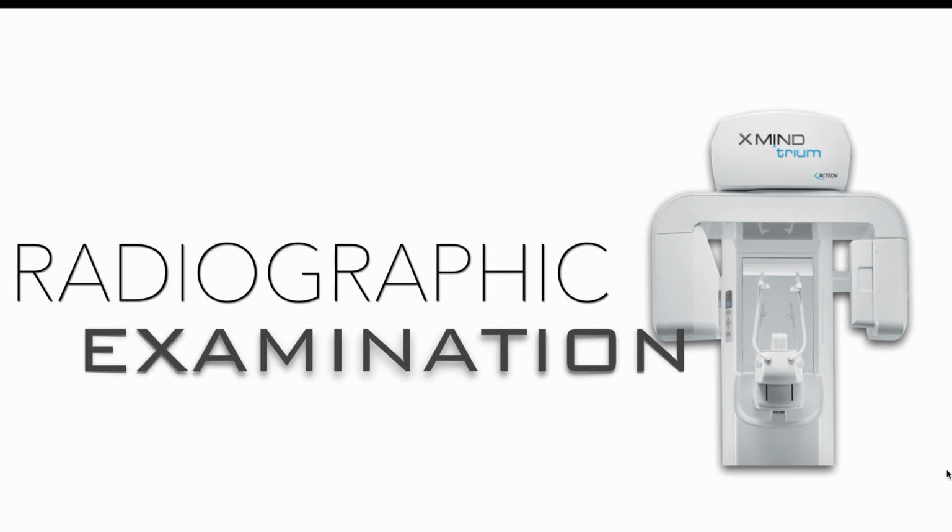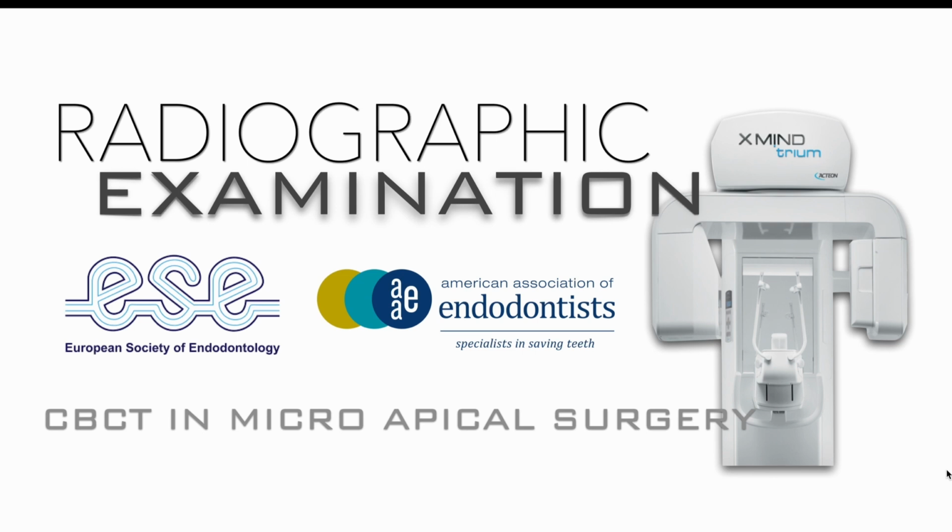But let's be honest, not every surgery case needs a CBCT. However, at the beginning you need to do a CBCT before starting, for many reasons: you need to decide the length of the root, you need to decide the area to be resected, you need to know even if it's a through and through lesion, and so on.